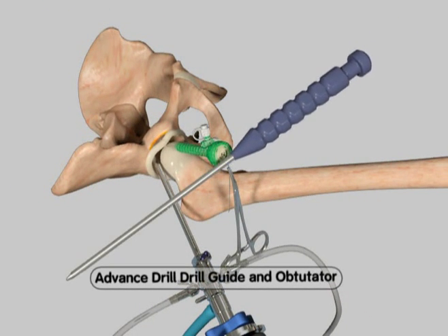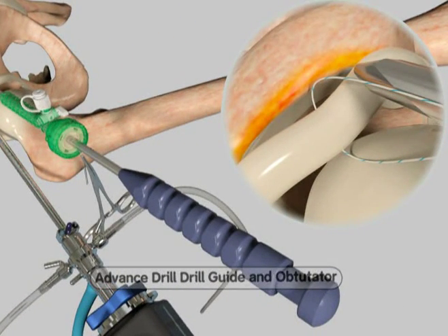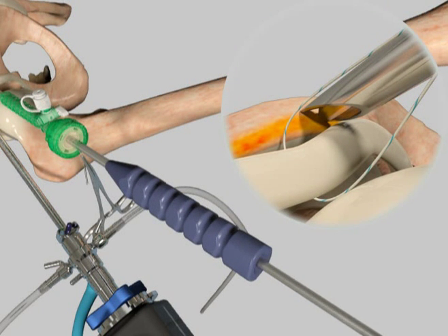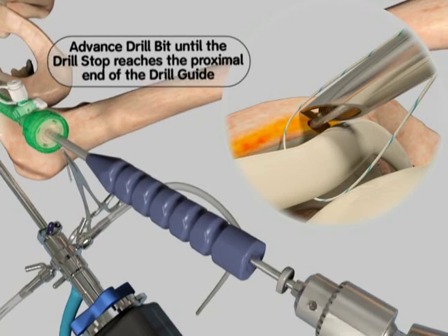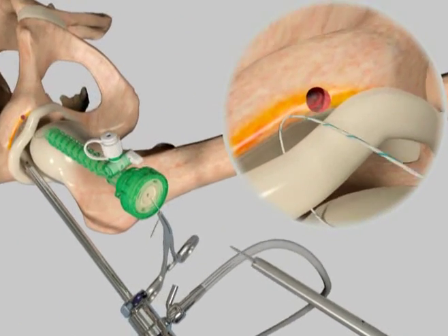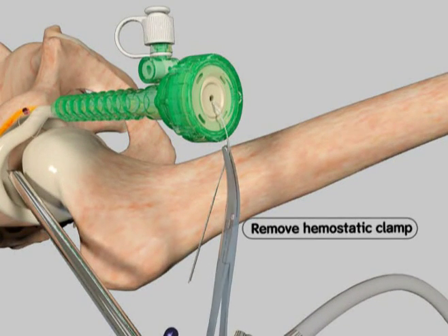Using the appropriate drill guide, place the distal tip of the guide against the acetabular rim. While firmly holding the guide in place, insert the proper drill bit and drill the hole. The depth stop on the drill bit will bottom out on the proximal end of the guide when the proper hole depth is reached. Remove the drill bit and guide. Unclip the hemostat from the sutures.